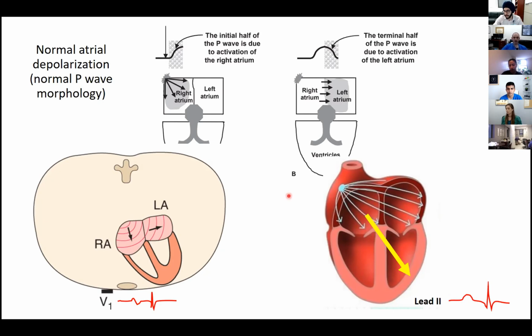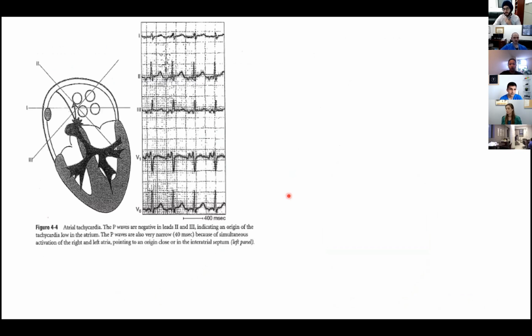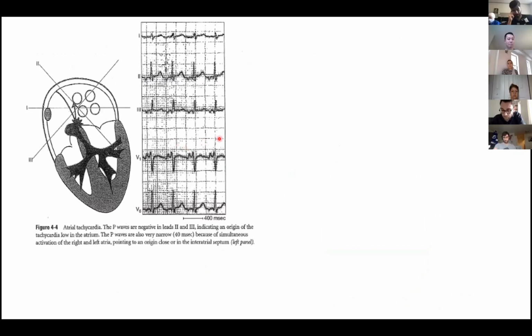now in atrial tachycardia, it's all about analysis of the vector of the P wave. These photos look a little bit archaic, but the textbook is not as old as the scan is pretty bad. But essentially, how are you going to analyze those P waves in atrial tachycardia? There's a very, very simple way to do this. Let's say you have here, if you look at my pointer, there's a little black star that says that this particular atrial tachycardia is initiated from the septal region and low.